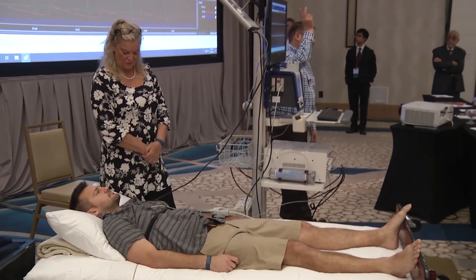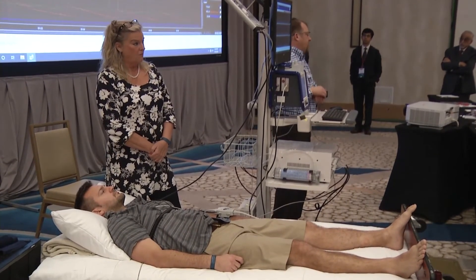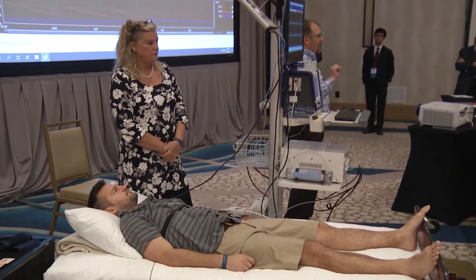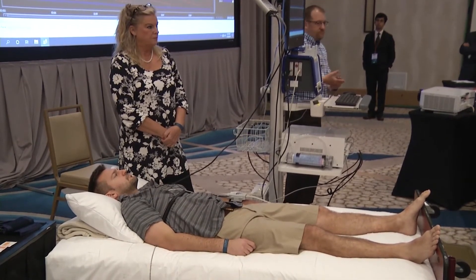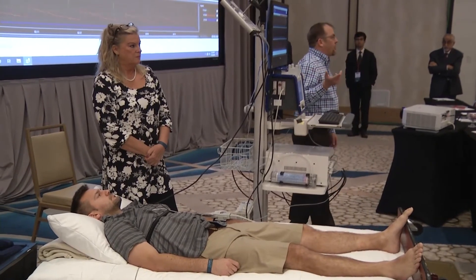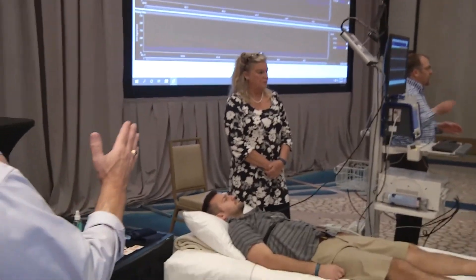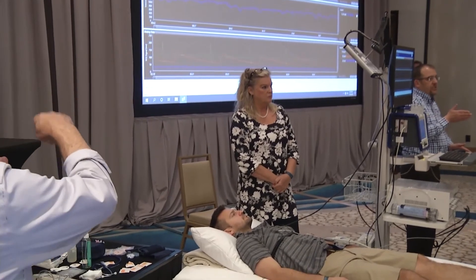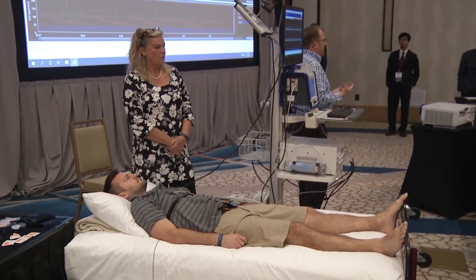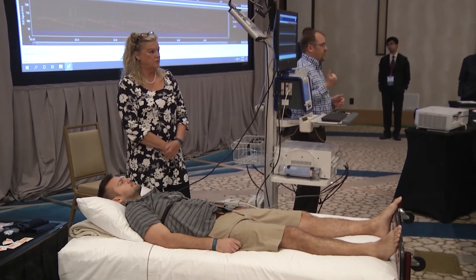We just have a metronome that constantly goes up and down, so it's really easy to instruct patients because they can see how much of a breath they're going to be taking in and out. This system will get started as soon as we tell the patient to go ahead and start their breath, and then once we hit start it will go up at that point. This system automatically marks for us — it puts a mark at the beginning and end of the eight breaths. We like to have it done at the half cycle so we can follow the breath in relation to chest expansion and know exactly where the peak and valley should be occurring.